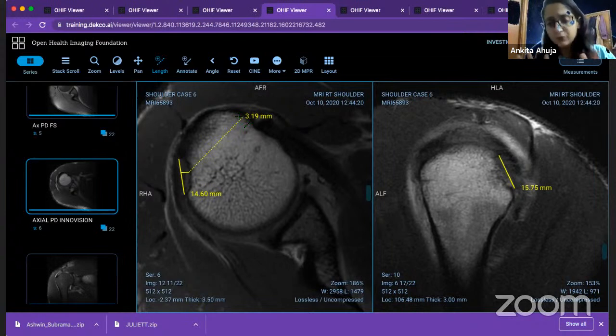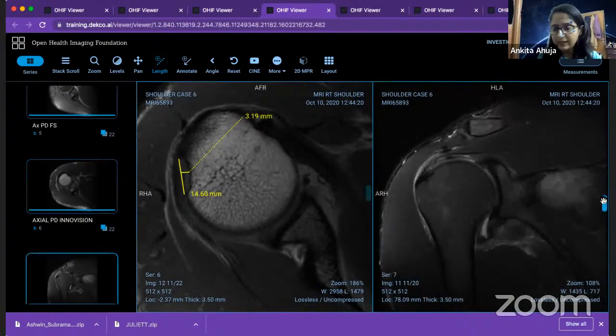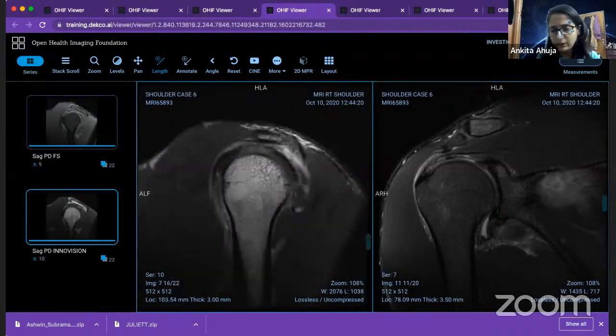That is the first thing you figured out within the bone. You were looking at the marrow edema, you picked out something, and now you know you're looking at a case of anterior instability. But I never change my path. I go through the same path to see all the findings and I compile things in the impression. So I'll follow my routine path because I saw a bony abnormality, I measured and mentioned it. But then I go back to my rotator cuff tendons.